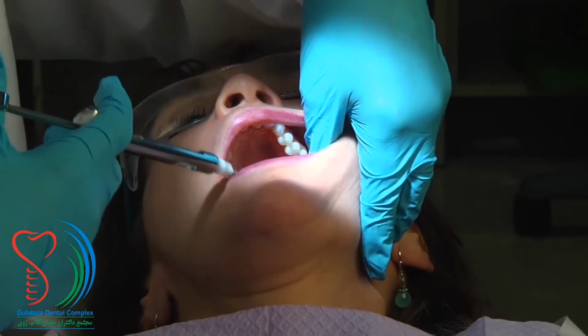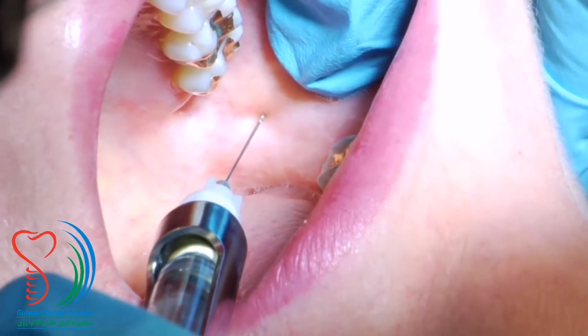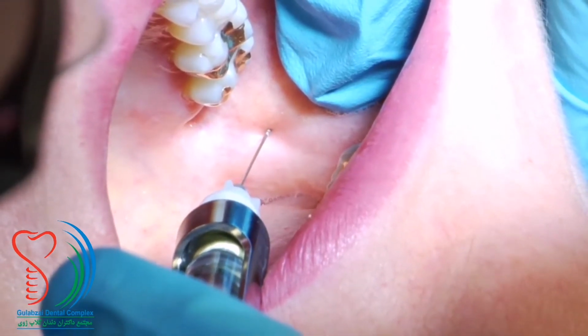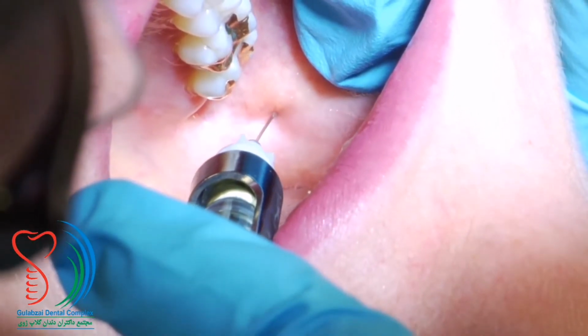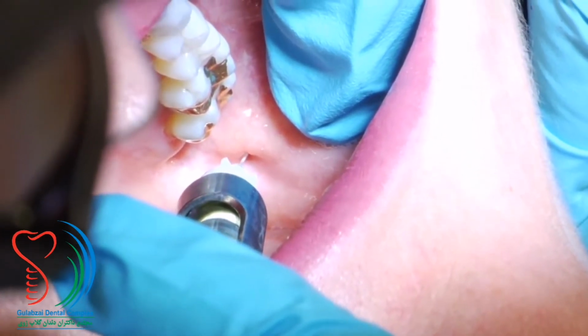The barrel of the syringe is parallel to the occlusal plane and will be positioned at the corner of the mouth and over the premolars on the opposite side. With this injection, you should meet resistance at your maximum depth of 1 to 1 1/4 inches, which confirms the deposition site near the medial aspect of the ramus.